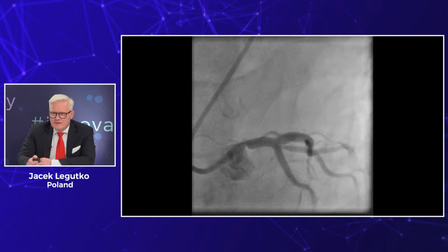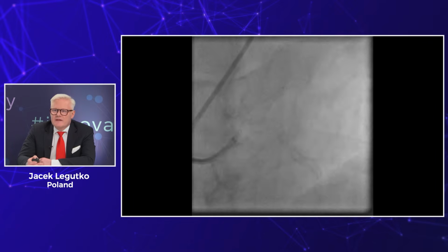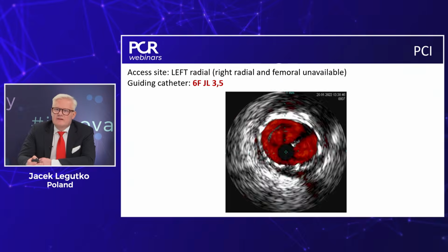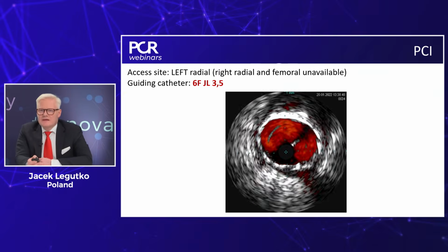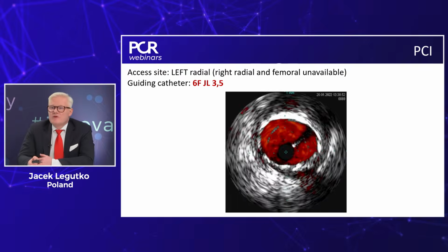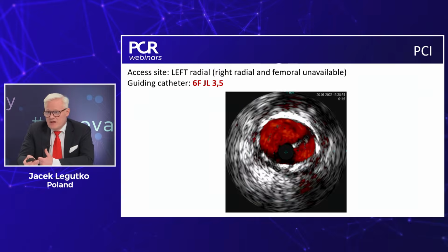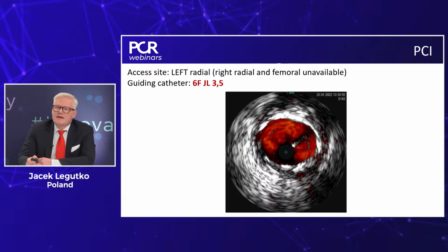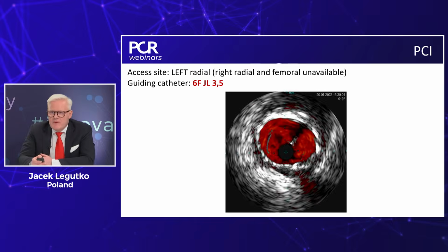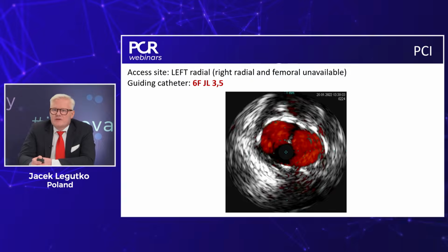And sometimes it takes a lot of time to appropriately find the way to the stent. I was not really sure if it was appropriate again. So again, I used 2 wires. And on the second wire, there was a probe, and finally, this probe entered the lumen of the left main. We will see if it went through the stent struts or see the IVUS catheter inside. The IVUS catheter is inside the left main, and I very gently pull it back. So this is very important, not to be too fast.